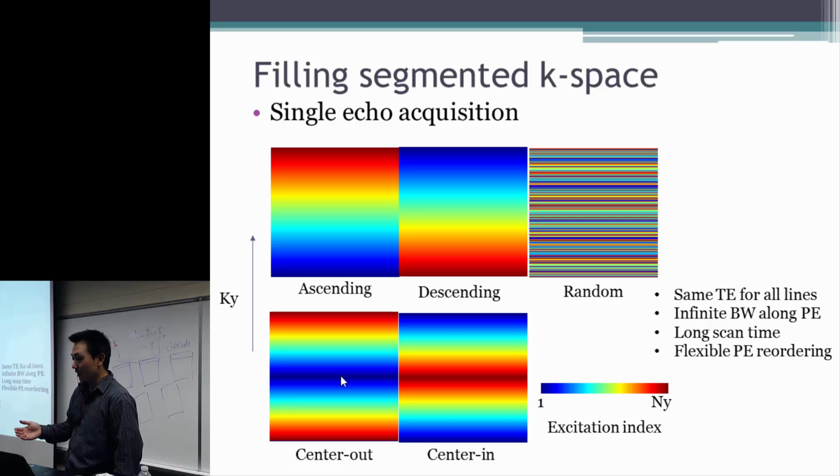For example, for some dynamic process. If we have injected a contrast agent into the blood vessels, that contrast agent decays actually very fast. Its half-life is mainly like 20 minutes. So we want to collect it as soon as the contrast agent is in the bloodstream.